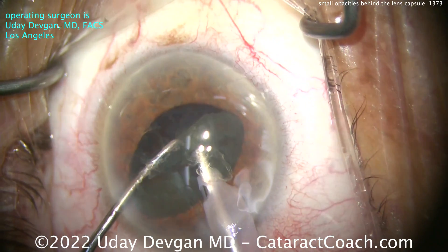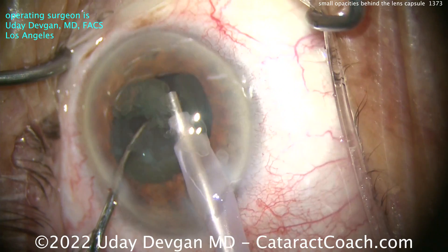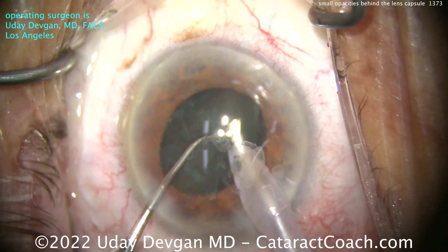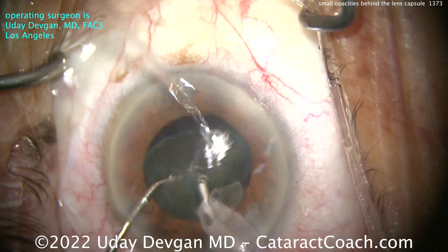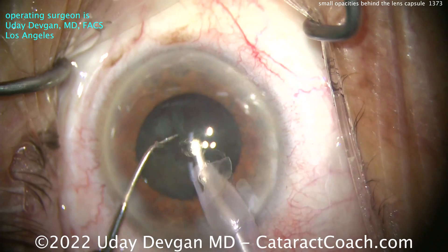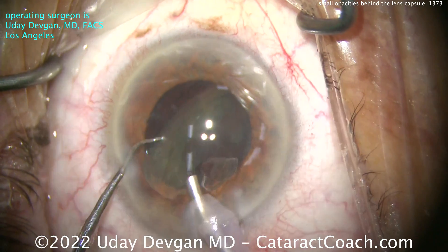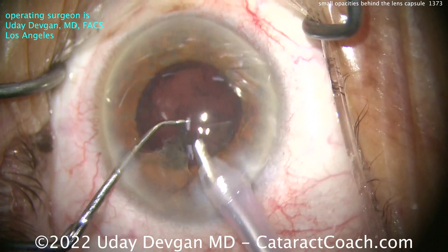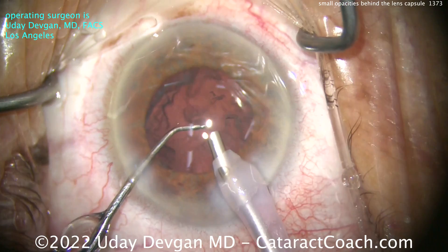So I want to continue removing this nucleus. You can see it's got a reasonable density — I've kind of prolapsed it partially up out of the bag. A little bit of a struggle here to get those pieces where I want them, but that's okay. Can't show you cherry-picked cases — I've got to show you the real world. This case is going to take just a pinch longer, about six and a half minutes instead of the normal five or so. Not a horse race — I just want a beautiful job. Taking that last hemi-nuclear piece and getting it up. I didn't sense any issues with zonular laxity during the case. The AC seemed pretty stable, other than maybe a little bit of floppy iris, but even that wasn't too bad.